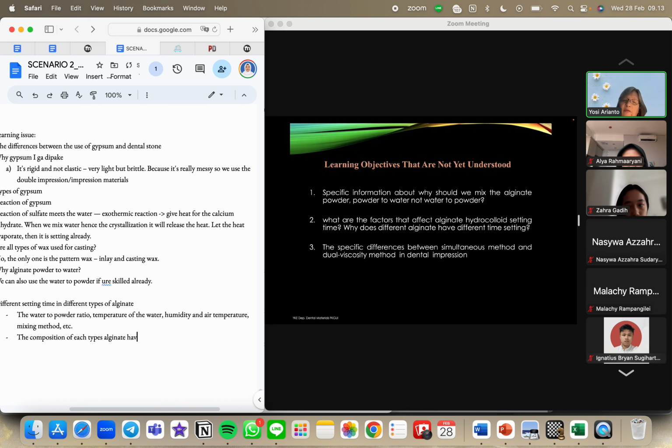Yeah, because of the different compositions. All the manufacturers have their own compositions, and how to manipulate and also the proportion. So if you use alginate, you have to know the instructions from the manufacturers.